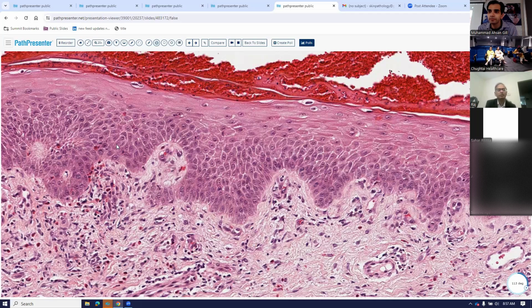And if this was on the board exam and you saw this eosinophilic exocytosis, then pick bullous pemphigoid, because that is a very classic thing that you see in the early phases of bullous pemphigoid. But again, remember, in real life, it can also happen in a drug eruption. It can also happen in an arthropod bite reaction. So just based on this, you cannot give a definitive diagnosis. You need more clinical input to give the definitive diagnosis. But on the board exam, pick bullous pemphigoid.